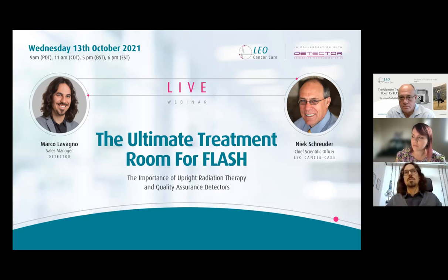To be honest, FlashQ is tuned for high current, so there you have a background because it's conceived to measure the high current. But having the capability and the possibility to tune your electronics to have both the measurements for conventional and clinical rates and flash rates is feasible with a double setup in the same monitor, in the same device.